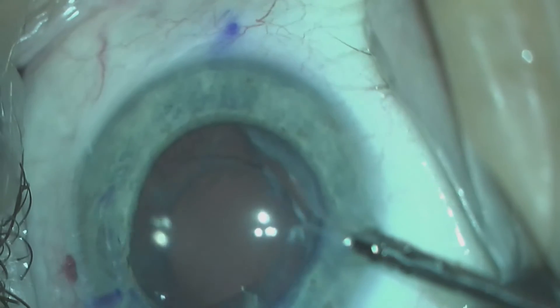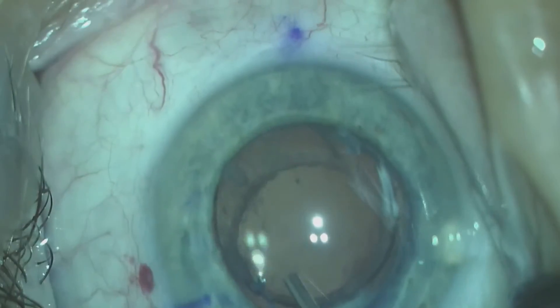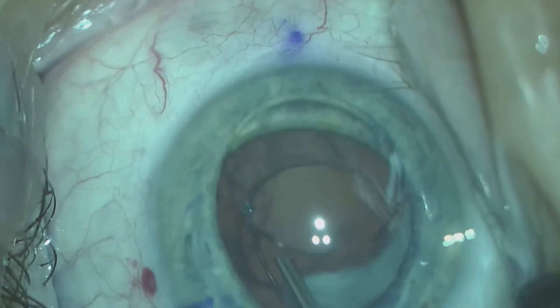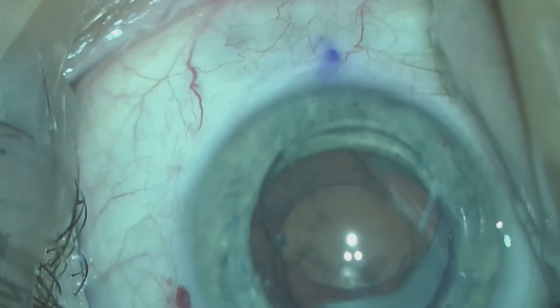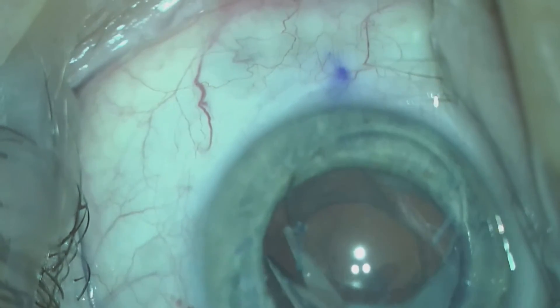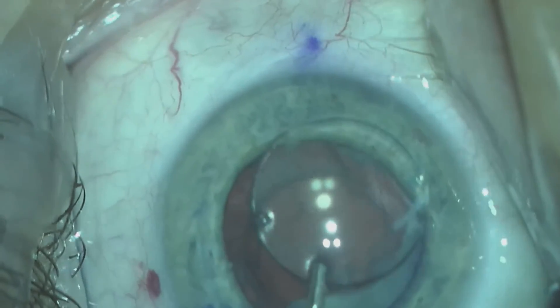At this point, I used the MST micro scissors and micro forceps to cut the haptic at 12 o'clock. The haptic at 6 o'clock is not yet cut, but that will be the next step. I tried to just spin the lens out of the bag, but the remaining cortex proved this to be too difficult. So the trailing haptic is also severed.